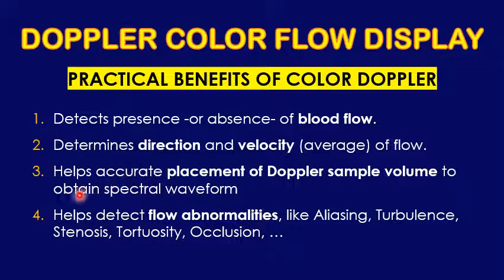Third thing, it helps accurate placement of the Doppler sample volume to obtain the spectral waveform. It's better to have color so that you can place the sample volume, or the gate, for the spectral waveform. Although it's not necessary, you can use the spectral waveform without color, but color can still help you with more accurate placement, especially if there are tortuosities or any pathologies in the vessel and you want to put the sample volume within the flow. So this is the third benefit.